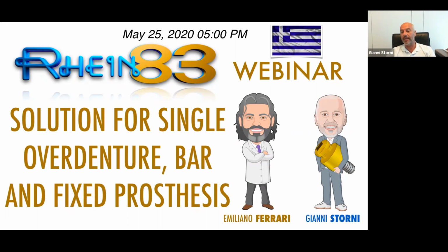Together with me there is Dr. Emiliano Ferrari. Good afternoon. We are really glad, as Emiliano is first of all a friend, then a great dentist, and also a technician. So he can speak also on the technical side of the lecture, because he has the knowledge about that.